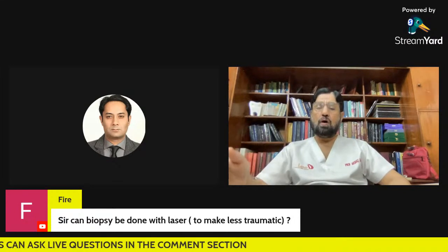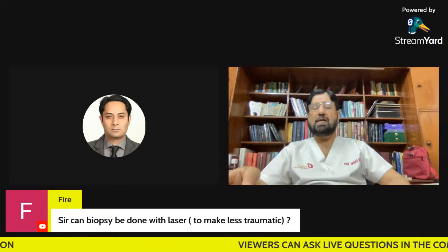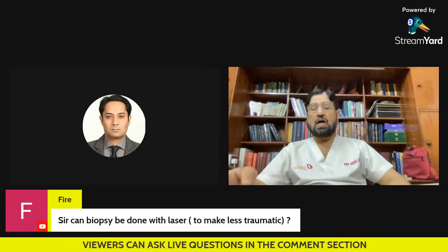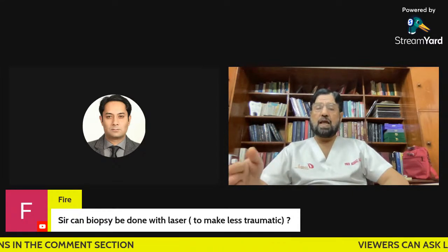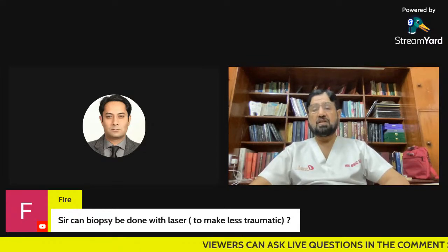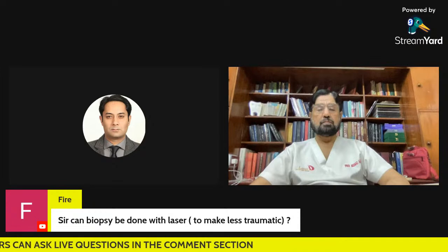at low joules. You are not allowed to use it at a high joule level. High energy can distort the histopathology of the biopsy tissue, but with low joules and less energy, definitely it gives you a promising result. Right, sir. Okay.